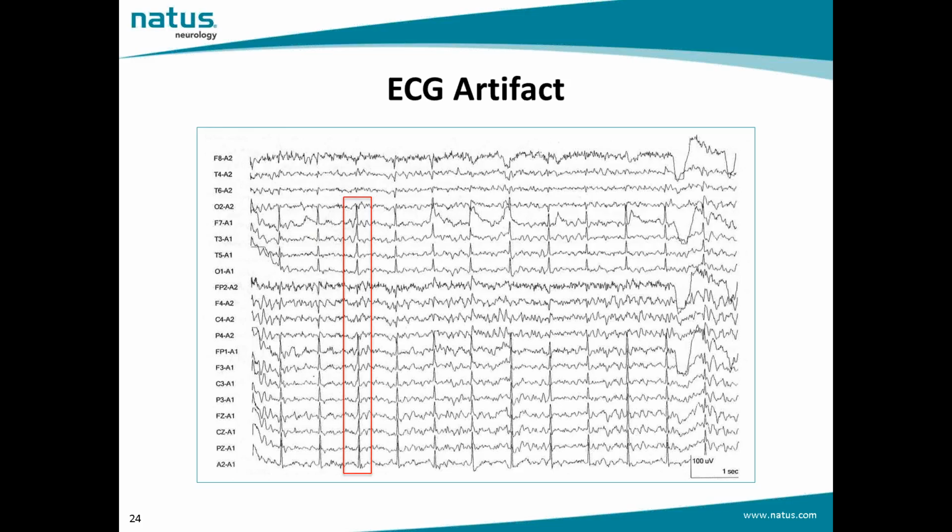Usually, the ECG activity is not present in the EEG recordings because the cardiac and the brain electric fields are equipotential, but in some patients, some ECG artifacts can occur during the recordings, showing repetitive peaks with the same frequency as the heart rate.